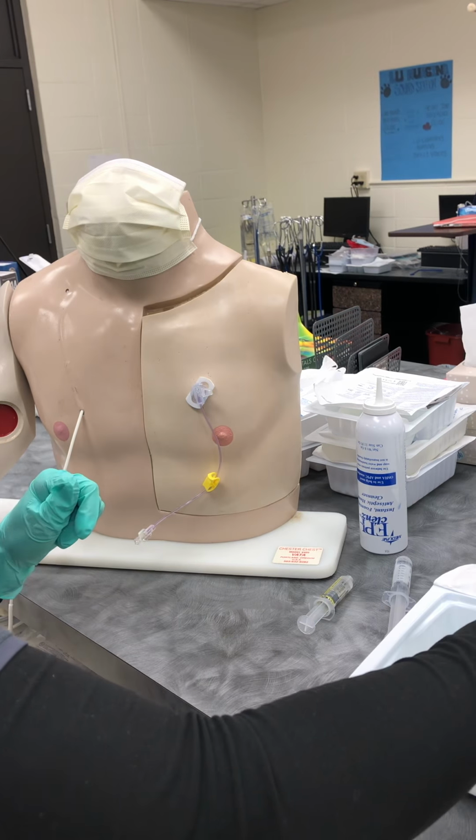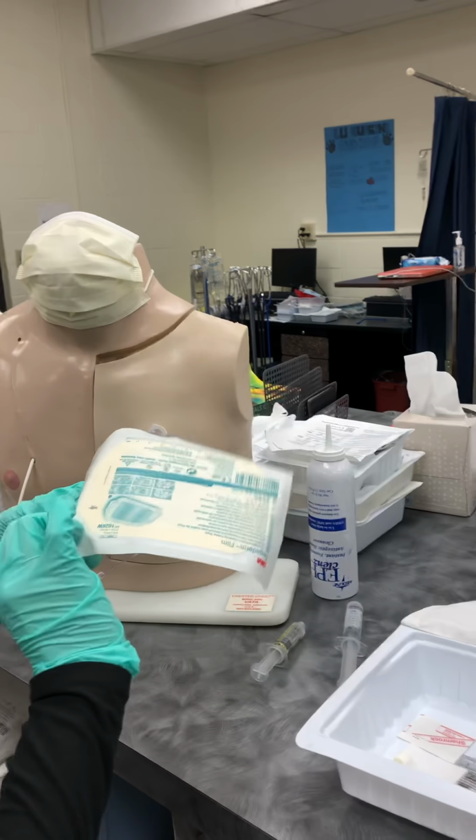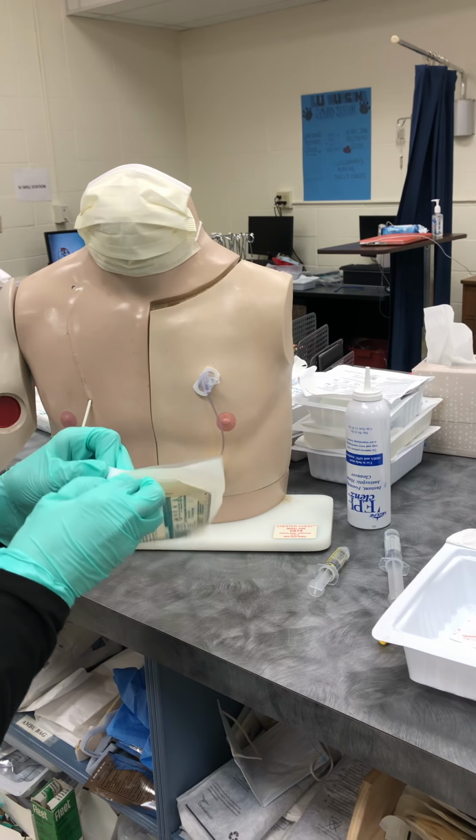And now we're going to get our dressing, which is our Tegaderm. I'm going to open this up.